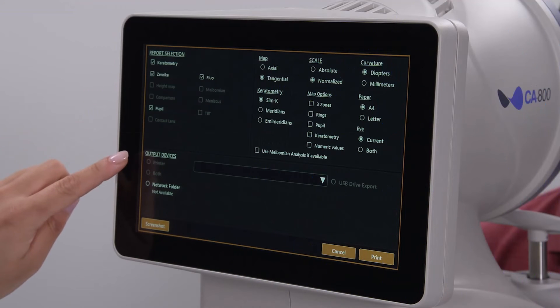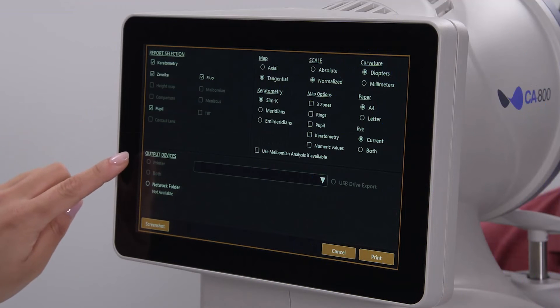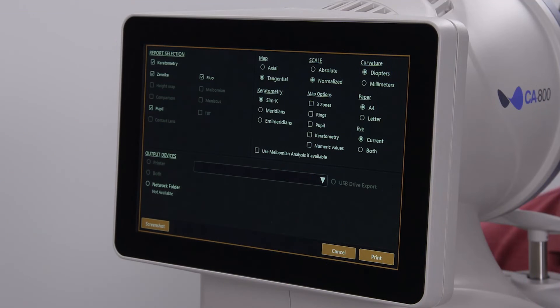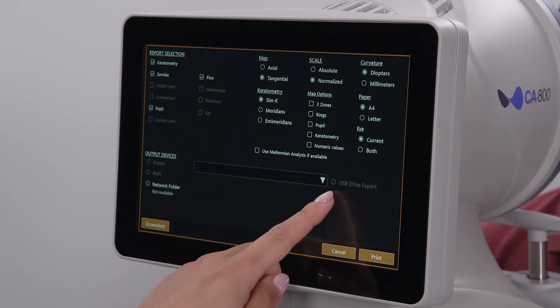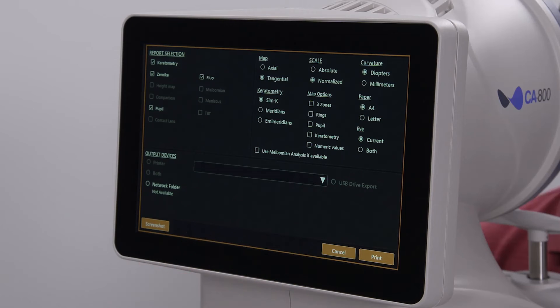In the output devices area, you can select to send the report to a printer or export it to the location defined in the settings menu, or both. There is also the option to export to a USB drive plugged into the USB port of the device. Once everything is configured the way you'd like, select print at the lower right corner.